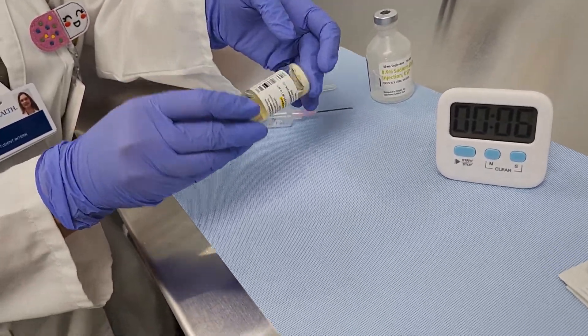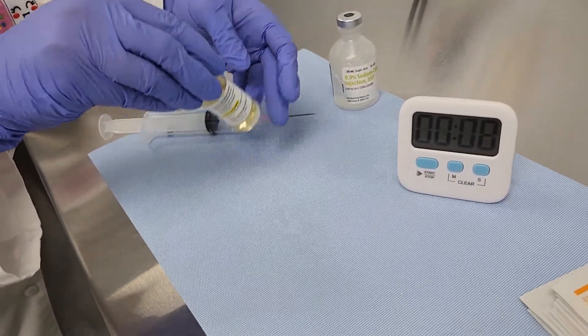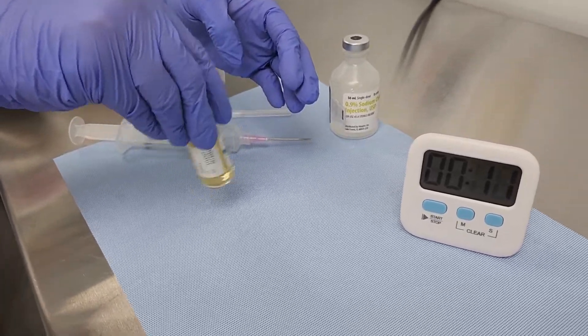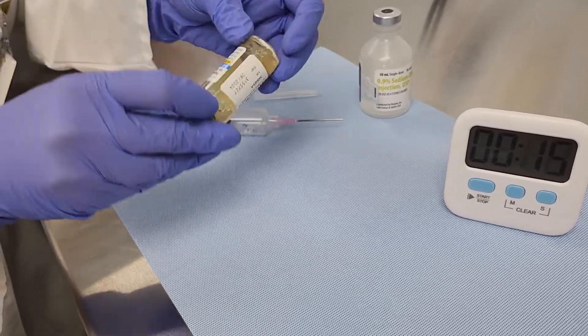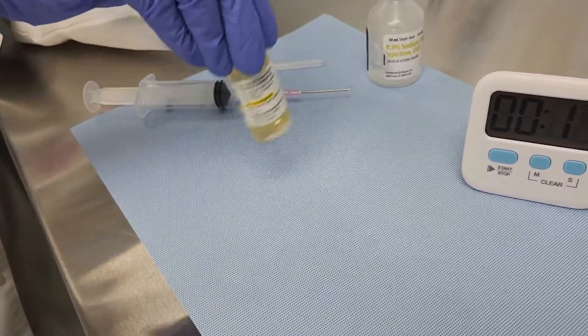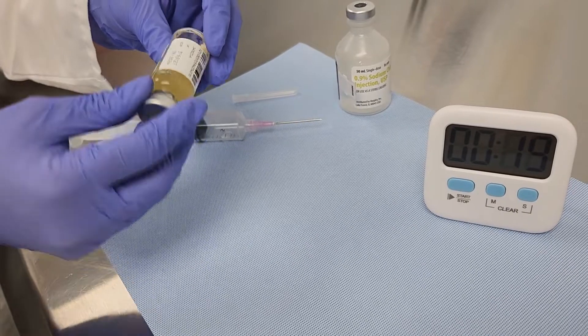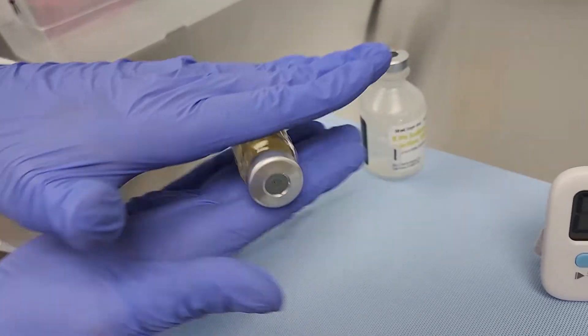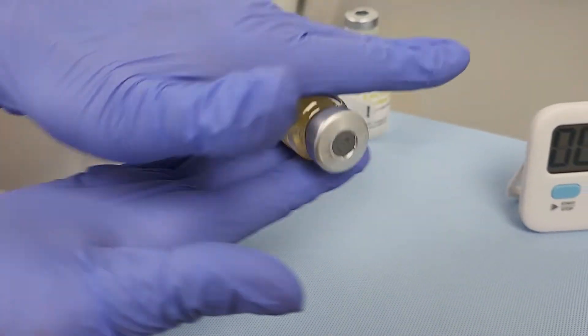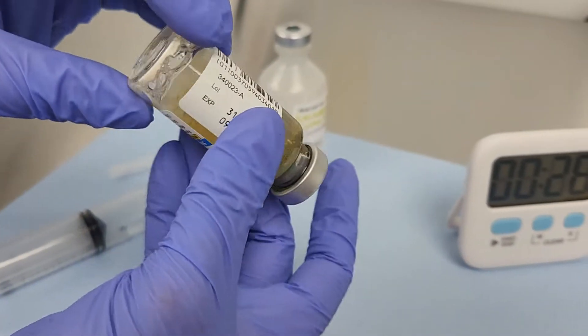After injecting the saline, gently agitate the vial by swirling, inverting, tilting, and rolling for approximately 60 seconds. The purpose of this step is to ensure that all powder is wetted, which will allow the powder to dissolve more quickly. Some foaming during this step is okay; however, do not shake the vial, as shaking will cause extensive foaming and prolong the reconstitution time.